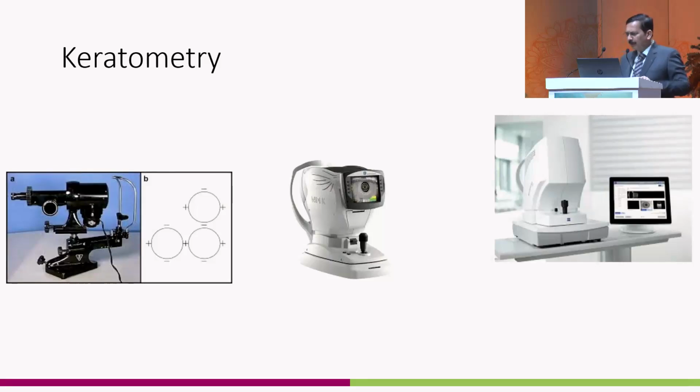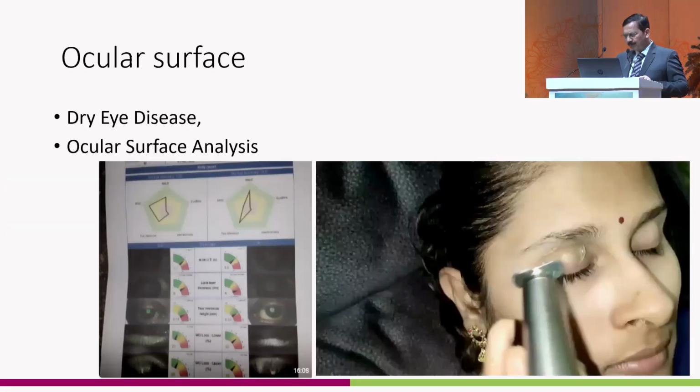Since we are going to mainly focus on corneal astigmatism, keratometry plays a very important role, even though we can measure central keratometry value in many ways. But what I feel is, whatever way of measuring keratometry for corneal power for IOL power calculation in our routine practice is okay. I prefer keratometry from IOL Master 700, even though I do not have any financial interest in this, but I make sure that it correlates well with the other keratometry values from the autorefractometer and topography.